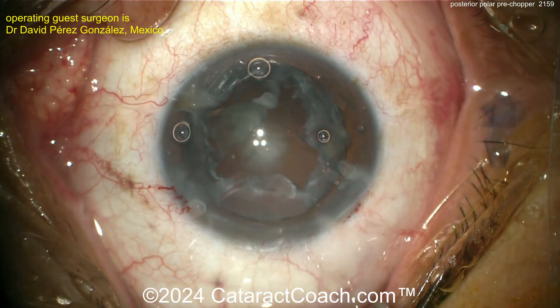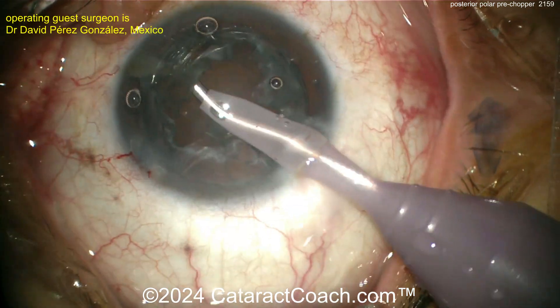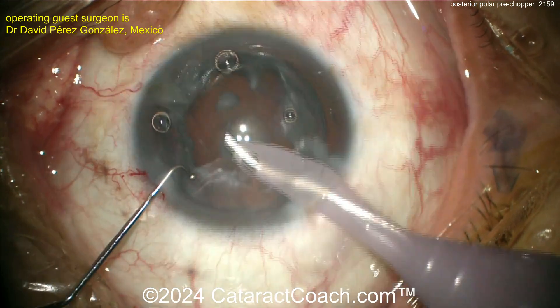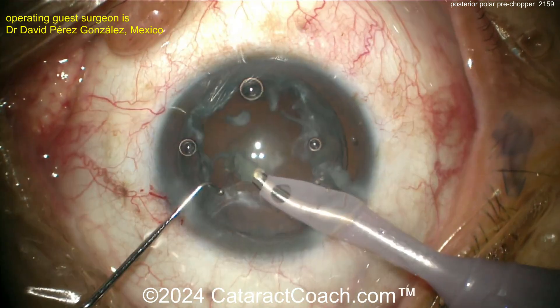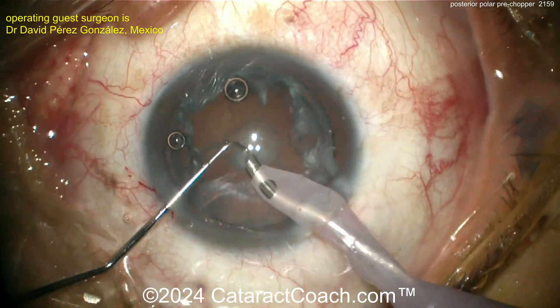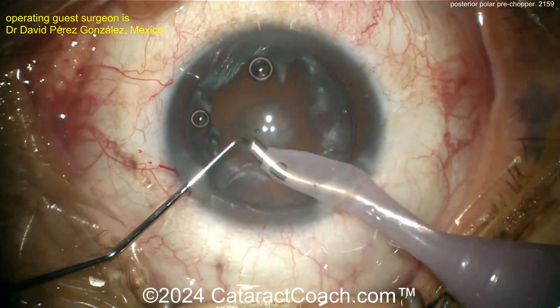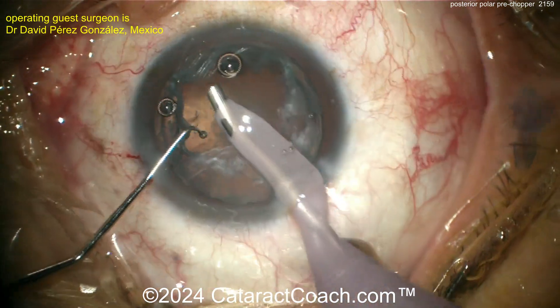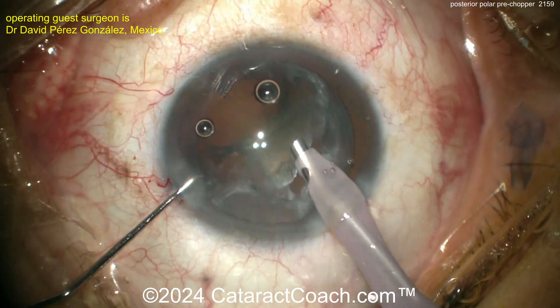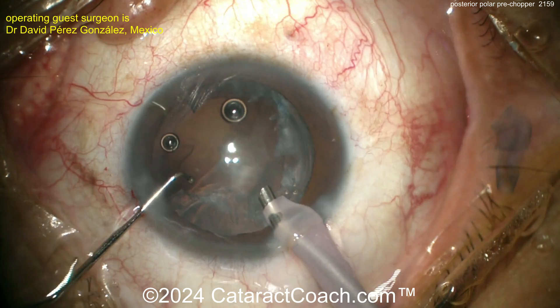A little more viscoelastic going inside the eye, then back to the phaco probe to get the little pieces out. Nice catch there with that smoke sign — if you want to know what the smoke sign is, go to cataractcoach.com and type in 'smoke sign.' It's caused by an impending phaco wound burn from a clogged tip. Taking out these pieces — very nicely done.